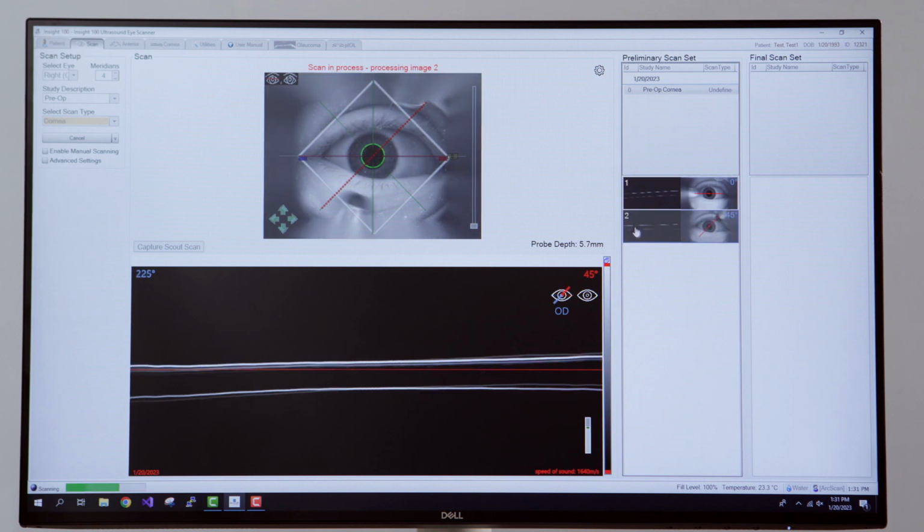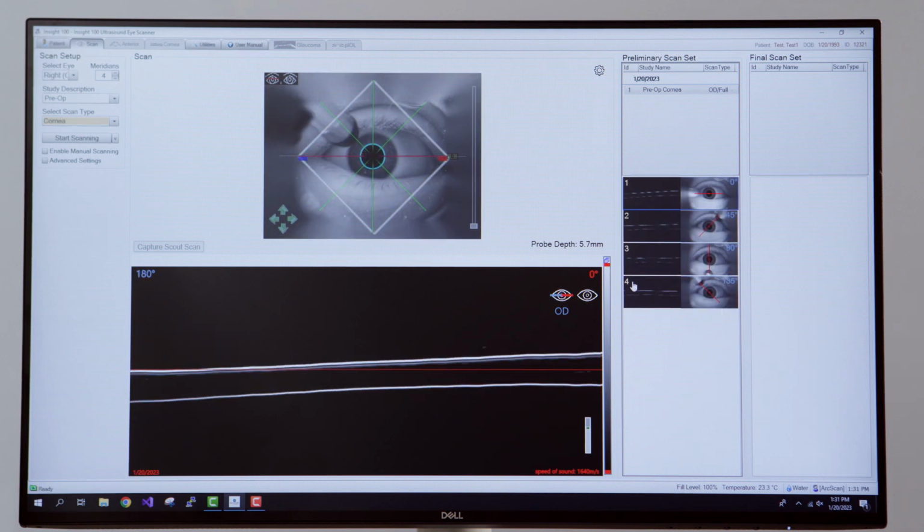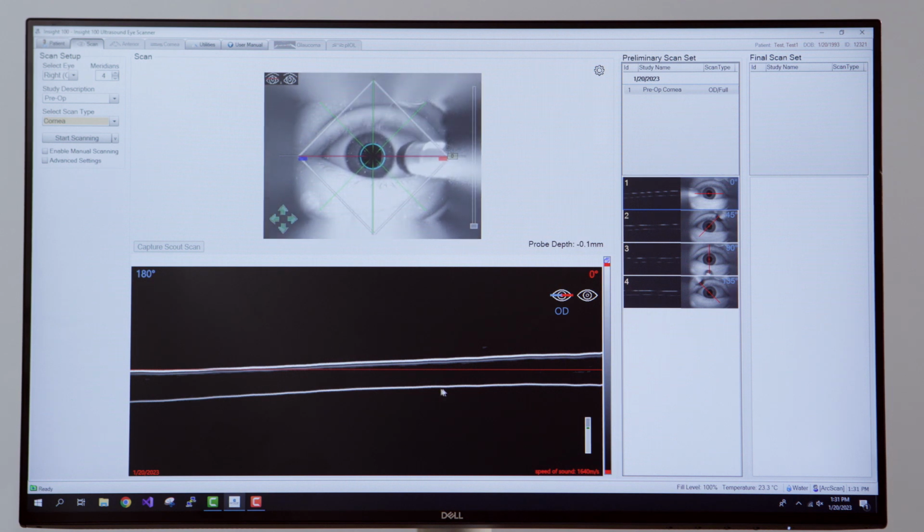If one of the images is not of the quality you would like, you can rescan just that single meridian with a right click on the thumbnail. Then click Rescan.